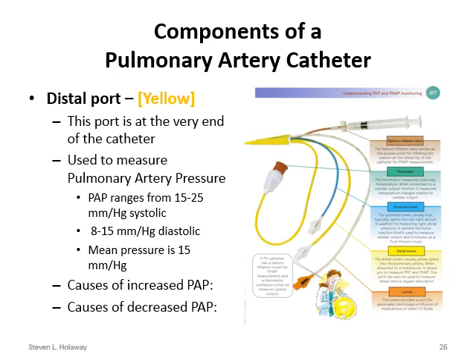And as part of that, when we're just looking at the PA pressures, when we're looking at non-wedge pressure, it basically is looking at the normal pulmonary circulation. The diastolic pressure reflects left ventricular pressures. So really what we're looking at is the pulmonary circulation and the right side of the heart circulation with this.